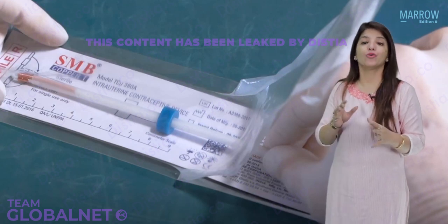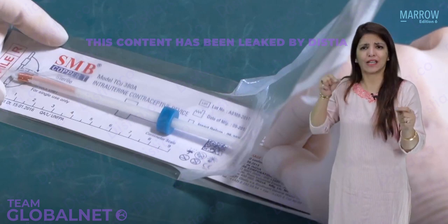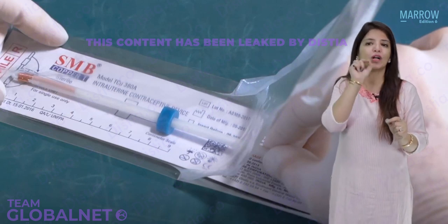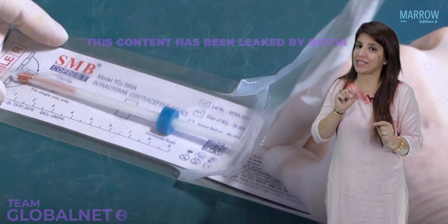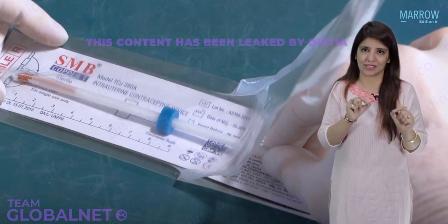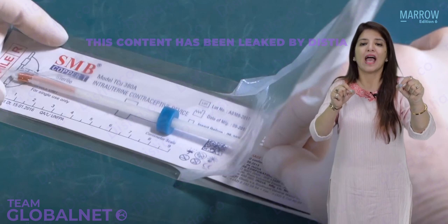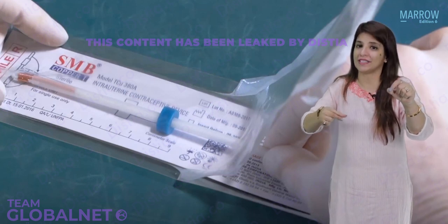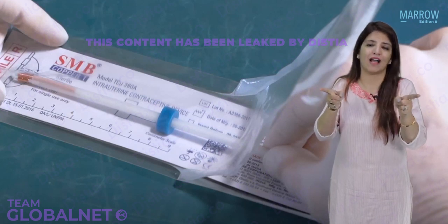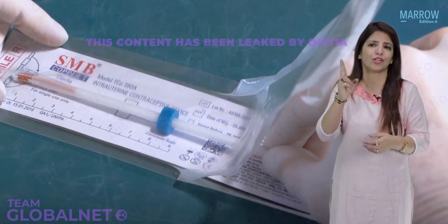Now I'll let you know how you have to insert the copper T. This loaded IUCD in the inserter and the plunger will be taken inside the uterus such that this blue colored gauge is lying at the level of the external os. Once the flange lies at the level of the external os, I'm going to stabilize the tenaculum and the plunger and slowly withdraw the inserter. The moment I withdraw the inserter, the arms of the copper T come out and my copper T is inserted. Then I'm going to cut the threads and that is all.